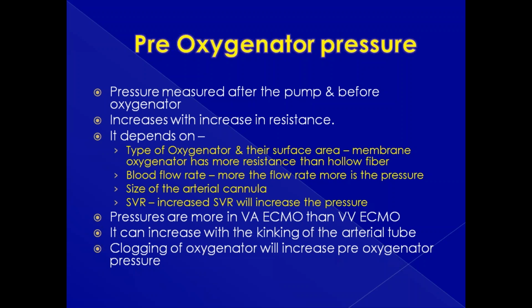Pre-oxygenator pressures are helpful, but ECMO can be done without them in some circuits. The current practice does say we need to monitor pre-oxygenator and post-oxygenator pressures. Pre-oxygenator pressure is the pressure measured before the oxygenator, as the name implies, that is after the pump and before the oxygenator.